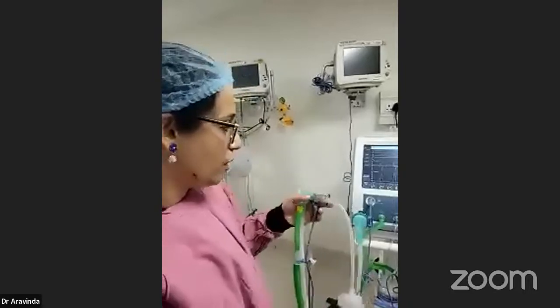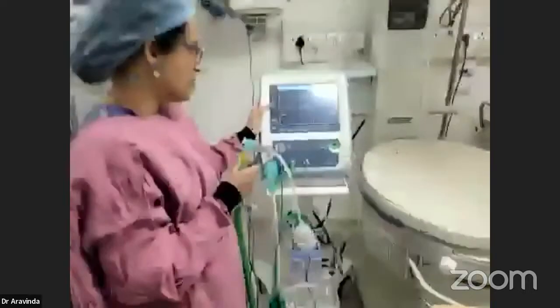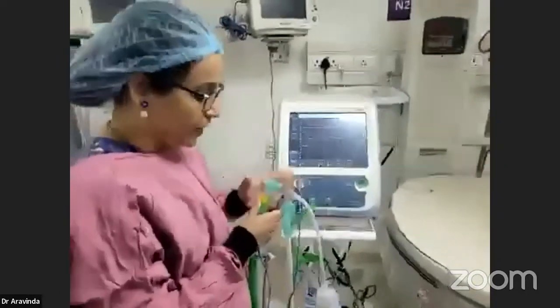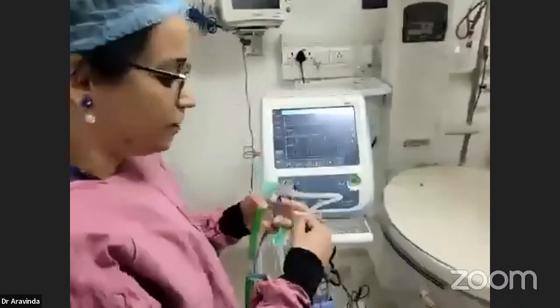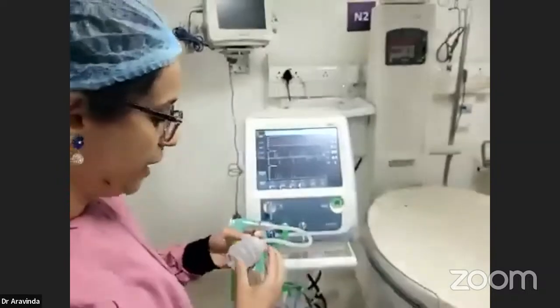Now we can see all three types of scalars: pressure versus time, flow versus time, and volume versus time, which we have already discussed. Now let's see what happens if the baby is trying to breathe.